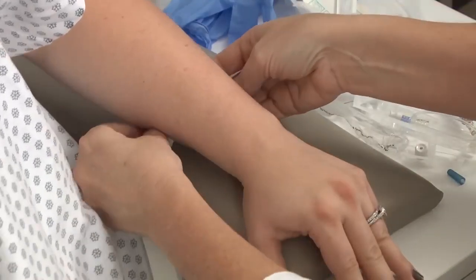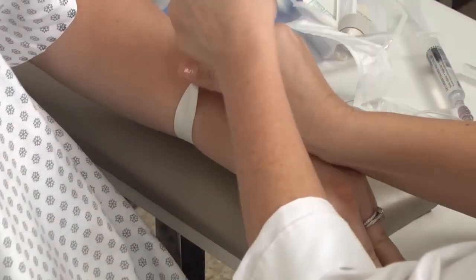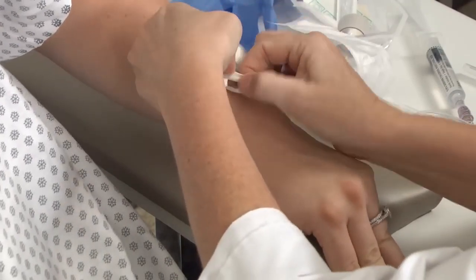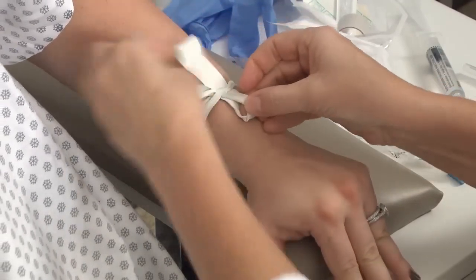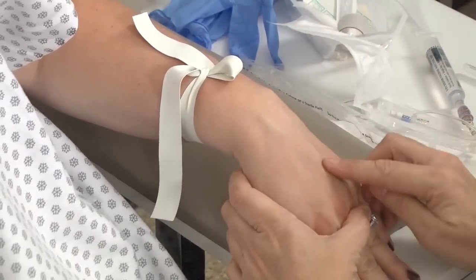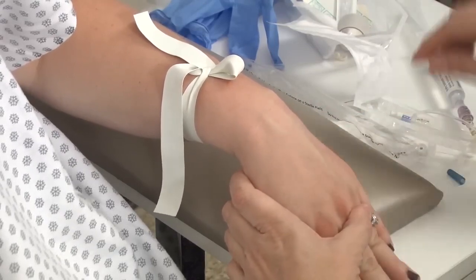Apply the tourniquet approximately 4 to 6 inches above the desired site. The tourniquet needs to be tied in a single-hand release loop, similar to how you tie a patient's restraint. Avoid joints and wounds when applying the tourniquet. The tourniquet will cause the veins to dilate and make them palpable. They should feel squishy, like a fishing worm.